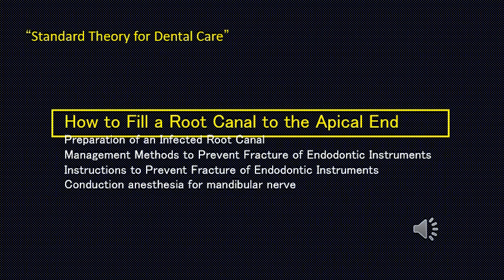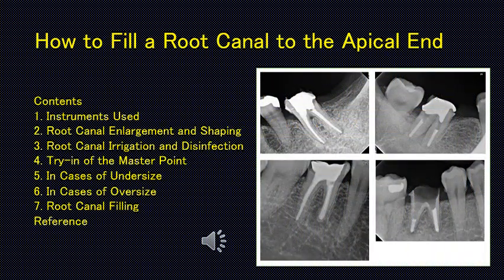Standard theory for dental care. How to fill a root canal to the apical end.